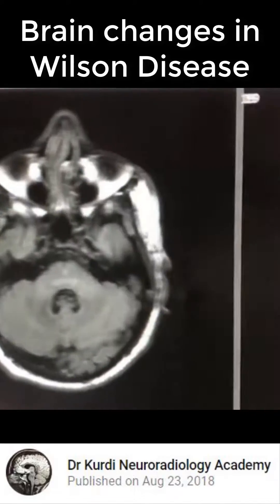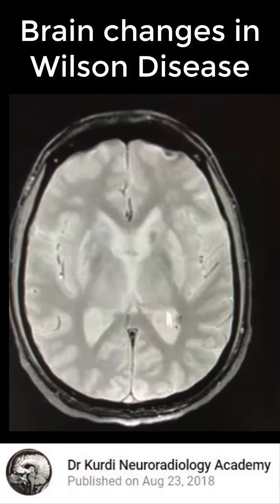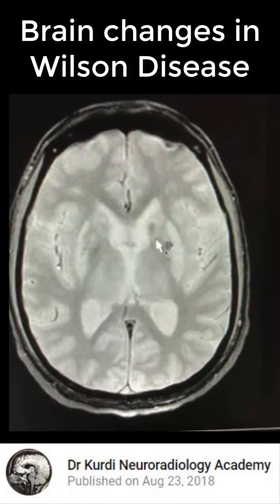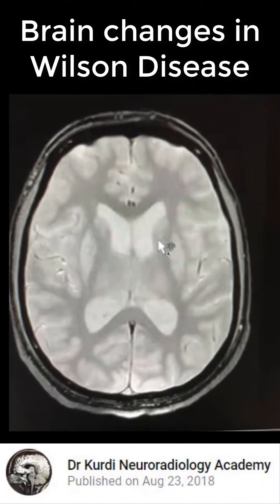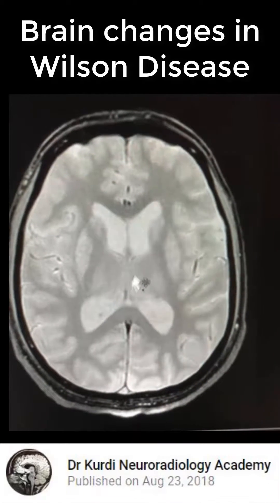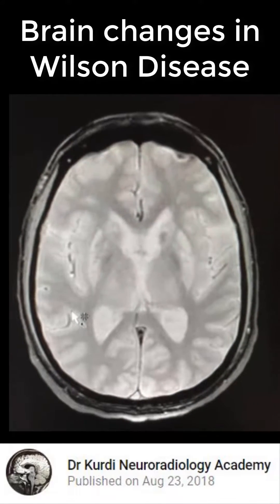On the gradient echo sequence, you see some mild low signal in the caudate heads, consistent with copper deposition.